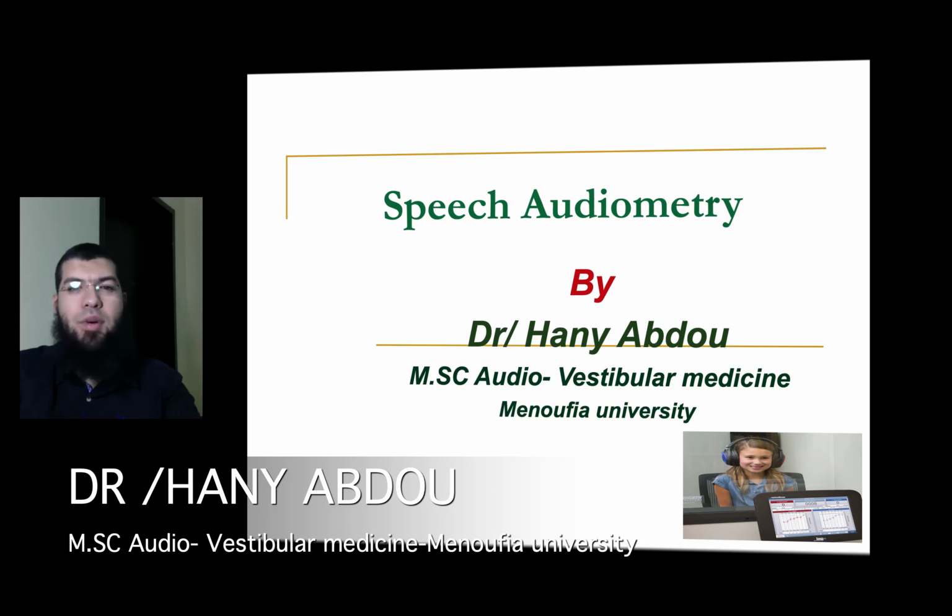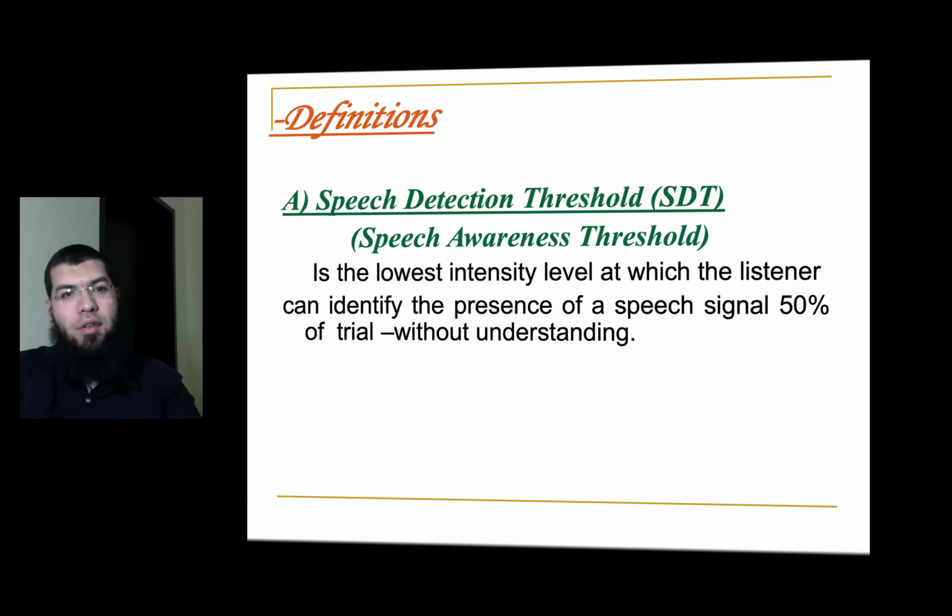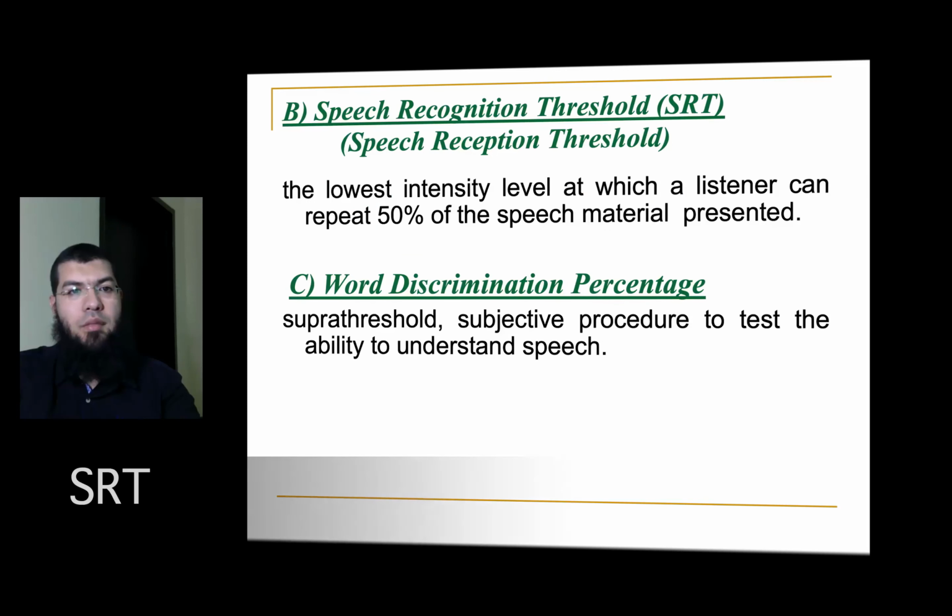My tutorial today is about speech audiometry. Let's move on. First of all, some definitions. Speech detection threshold, or speech awareness threshold, is the lowest intensity level at which the listener can identify the presence of a speech signal 50% of trials without understanding.